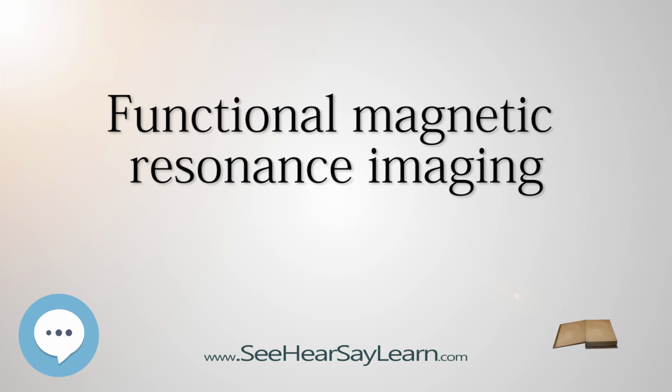Physiological noise is from head and brain movement in the scanner, from breathing, heartbeats, or the subject fidgeting, tensing, or making physical responses such as button presses. Head movements cause the voxel to neurons mapping to change while scanning is in progress. Since fMRI is acquired in slices, after movement, a voxel continues to refer to the same absolute location in space while the neurons underneath it would have changed.